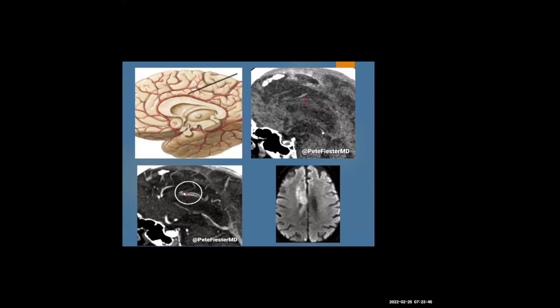Patient gets a CTA that shows that the pericallosal artery is occluded, and then presents with a right-sided stroke in the pericallosal artery territory. So the main point is that you can get a hyperdense artery anywhere, not just your MCAs. And two is if you correlate where a stroke occurs, you can work your way backwards and find out the likely vessel that was involved in the CTA.